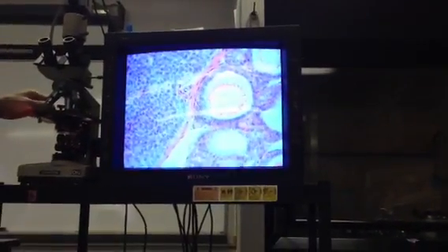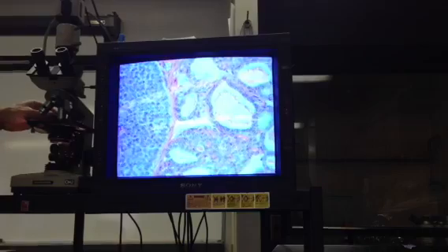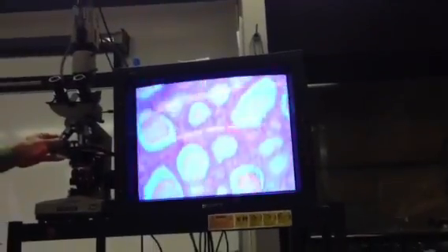Stole this. All right, so here we have thyroid and parathyroid. Again, I will always give you context. So you can see there's thyroid and parathyroid, remember? So this looks more like a pancreatic islet. I'm not going to show you that. I don't know what that is. But I'll obviously ask you for things that are more typical. The other thing that's often, this is a very atypical slide. And they're both almost the same.